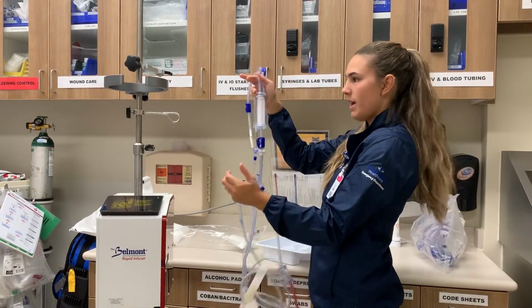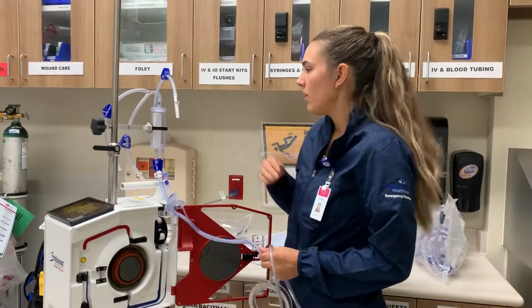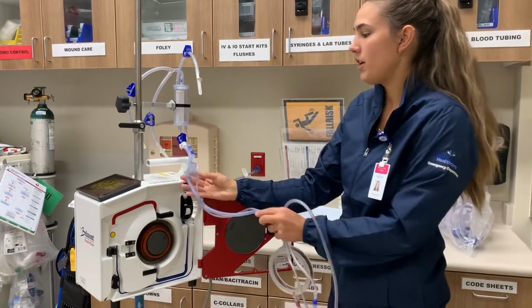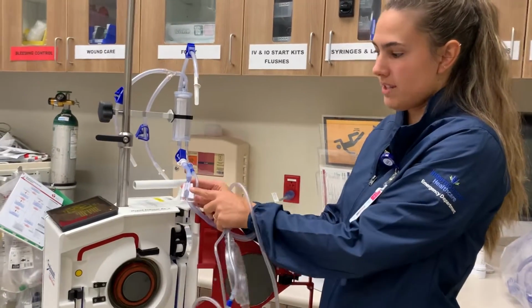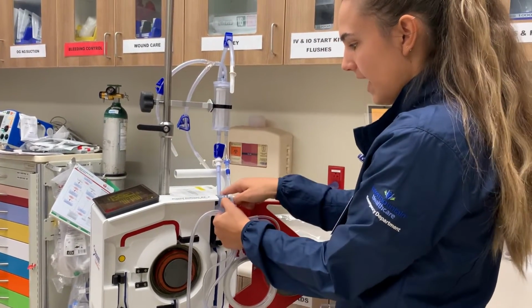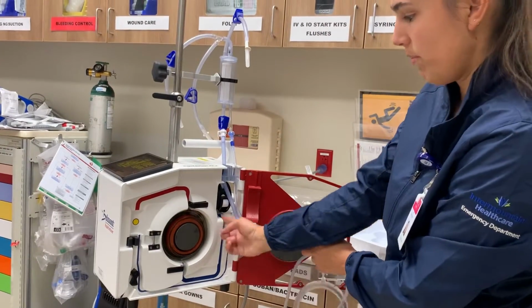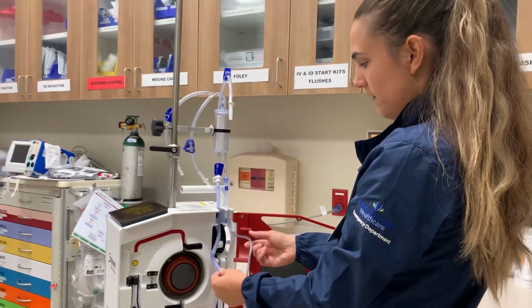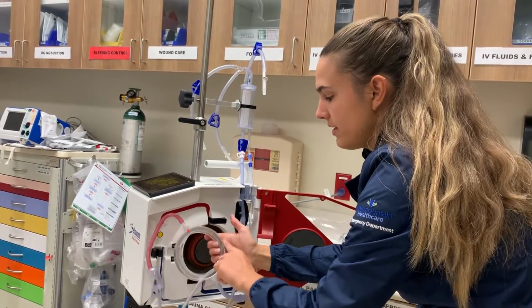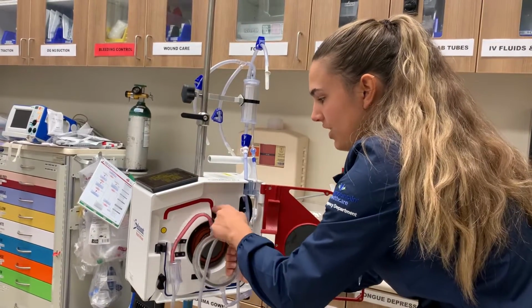This big chamber right here is going to pop into this little holder. Once you have your chamber attached to this holding part, you're going to find this little plastic tab that has this blue arrow on it, and the blue arrow is showing you to slide it into this little notch right here. There are 2 blue lines right here, so the left and the right tubing is going to follow those lines. And then you're going to get this cylinder, and there's a red arrow pointing up, so you know that is the top, and that's going to match up right here.